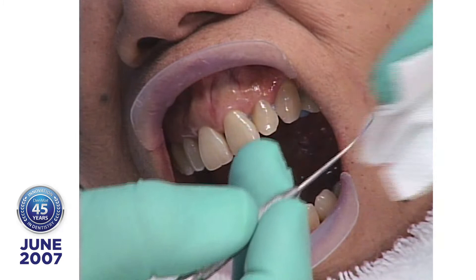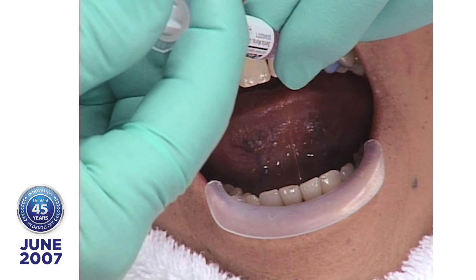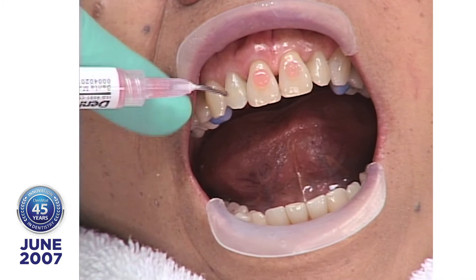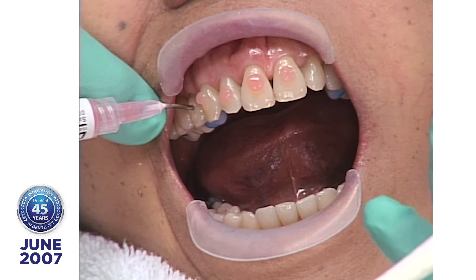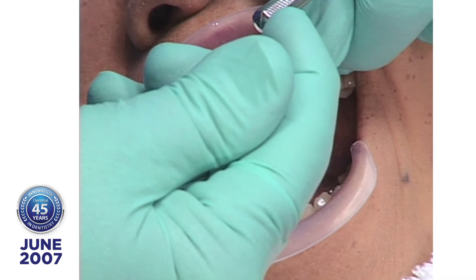There you can see it goes from the first bicuspid to the first bicuspid. Now we're going to begin surface preparation. I'm going to use 35% or 30% phosphoric acid with aluminum oxalate. Gwen has a fair amount of gingival erosion on that first bicuspid, so when I place that, I'm going to put a little excess on the tooth as well as in the lumineer on the left first bicuspid.